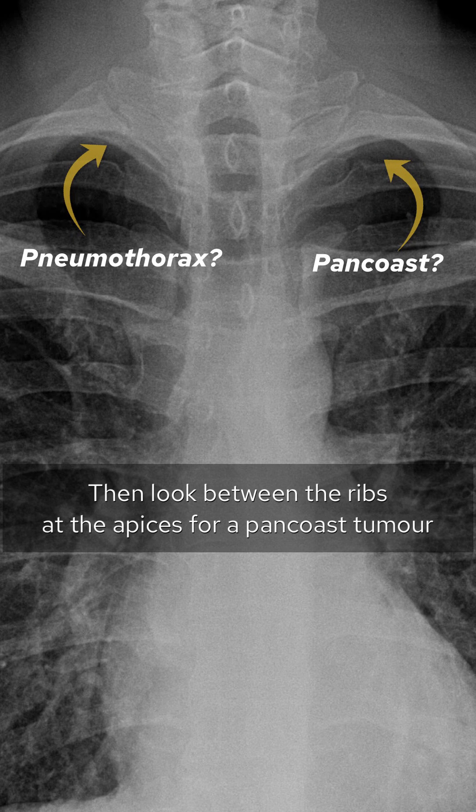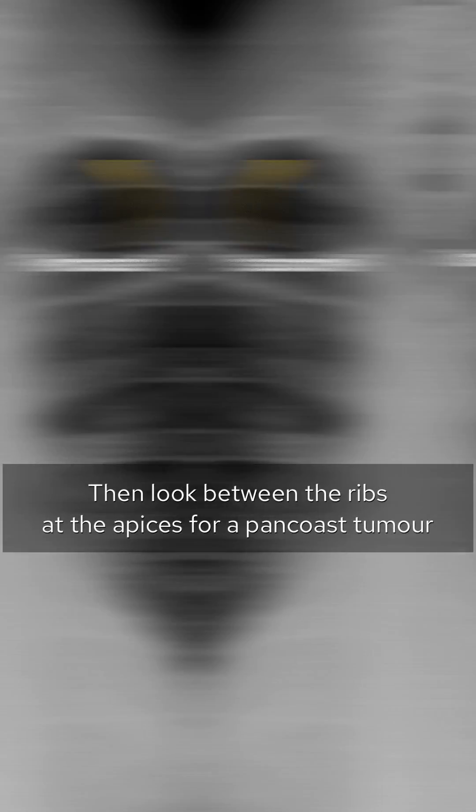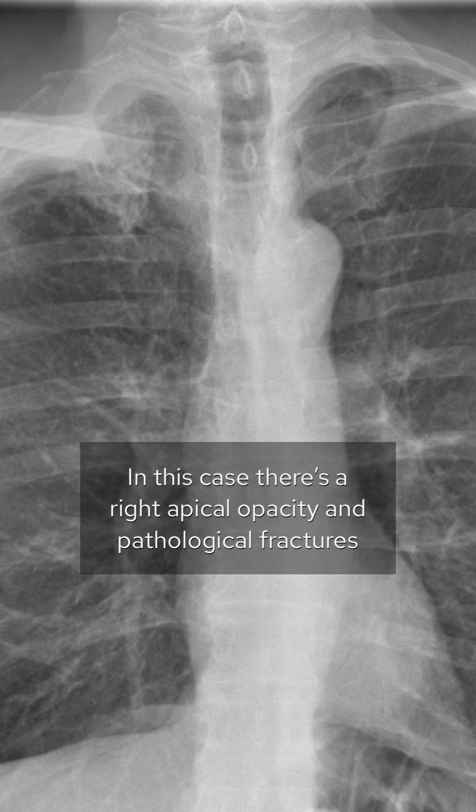Then look between the ribs at the apices for a Pancoast tumour. In this case there's a right apical opacity and pathological fractures.